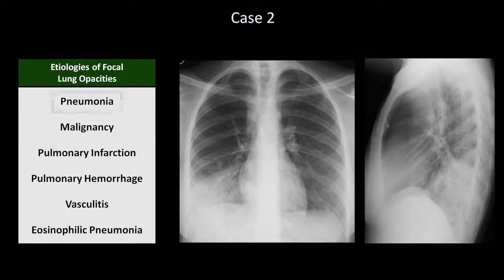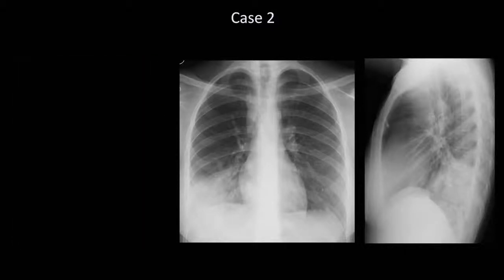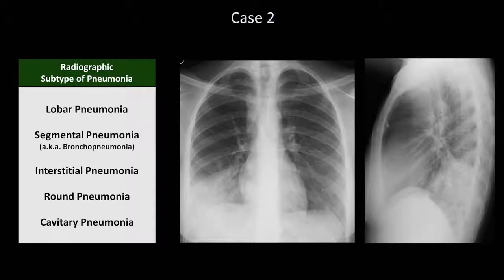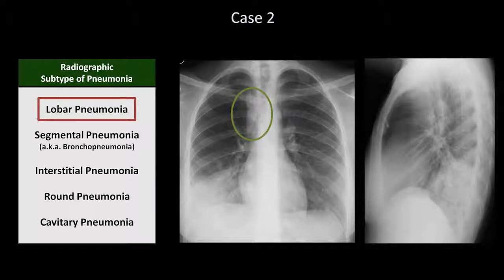In this case, pneumonia is by far the most likely. The patient is too young for malignancy to be likely, she has no suggestion in the history or exam of a DVT or PE, and the remaining diagnoses are much less common. In Lesson 8, I also discussed five radiographic subtypes of pneumonia. In this case, the consolidation is dense, appears to conform to the general shape of the right lower lobe, and there is no suggestion of cavitation. Therefore, this is a lobar pneumonia. In addition, although it is much more subtle, there appears to be some fullness just to the right of the trachea, which in the context of a probable pneumonia is most likely to be paratracheal lymphadenopathy.